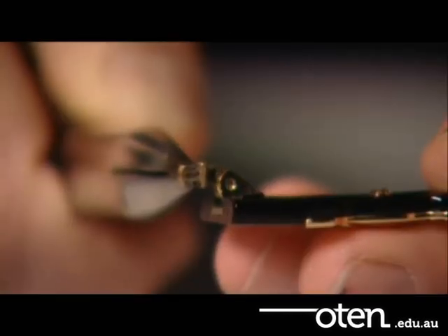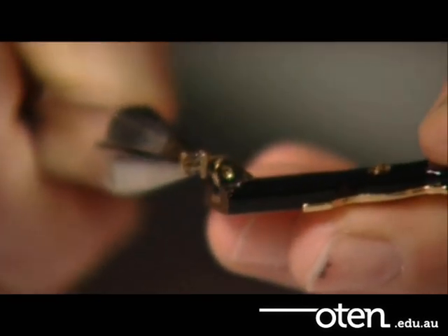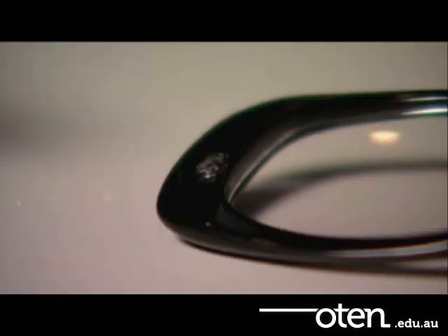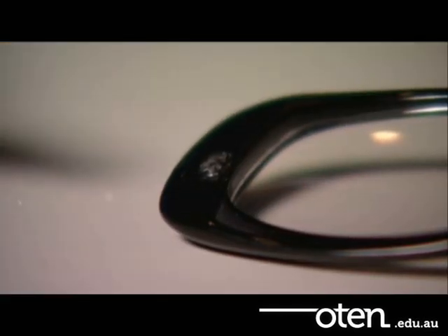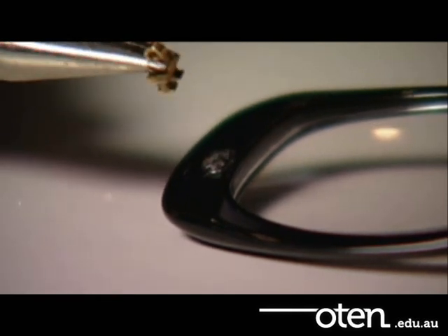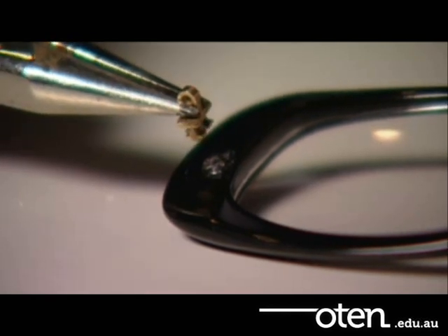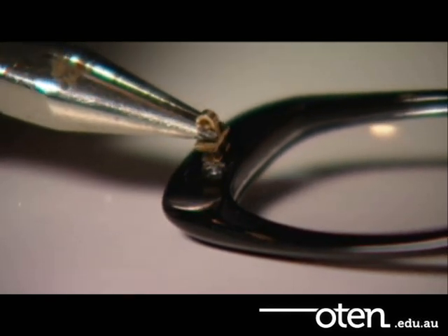Make sure that the barrel of your replacement hinge matches or fits with the temple hinge. Also, make sure that the hole isn't too big. Hold the new hinge with the tips of the contact pliers and position it over the hole left by the broken hinge. Make sure that you line this up correctly.